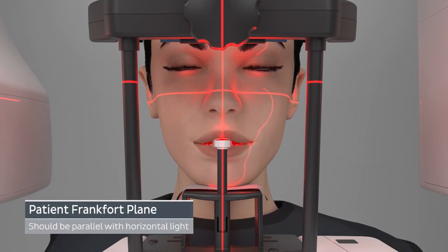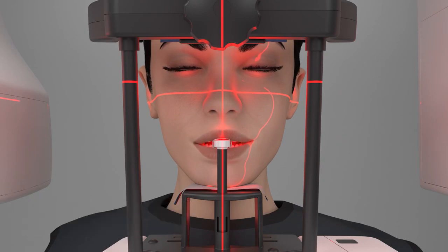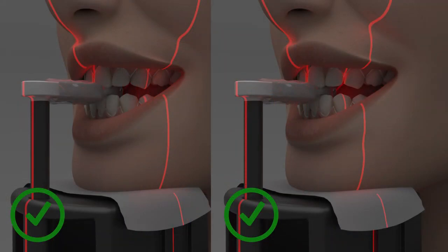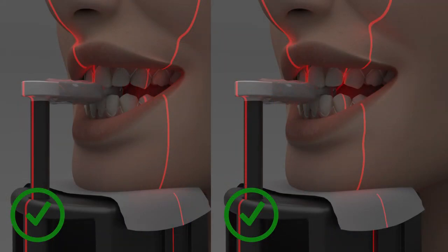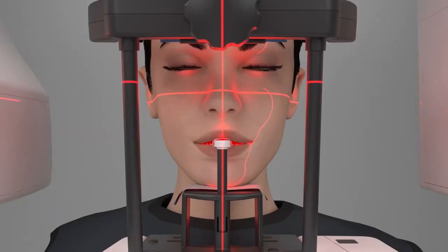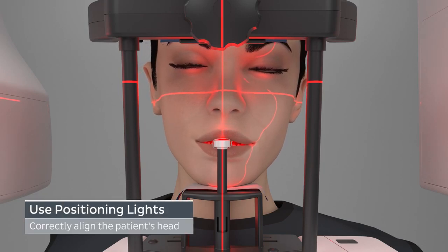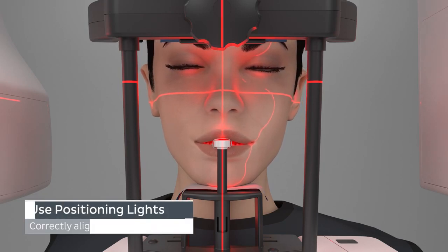For standard panoramic and pediatric panoramic alignment, the tilt light is approximately on the canine and the root tips of the lower and upper incisors. Compensate for mid-sagittal misalignments by manually moving the patient's head into the proper position.